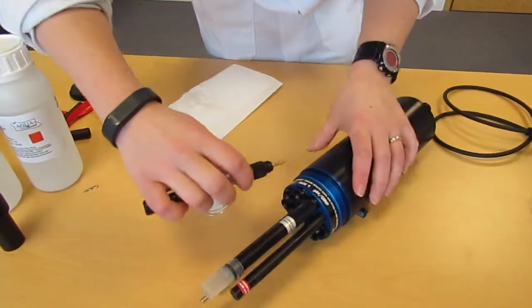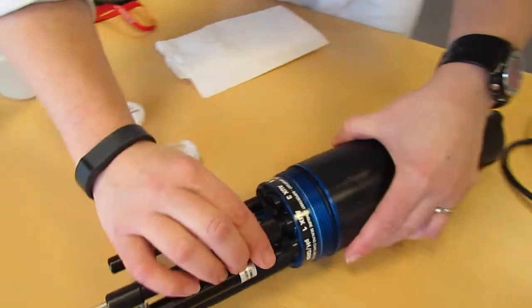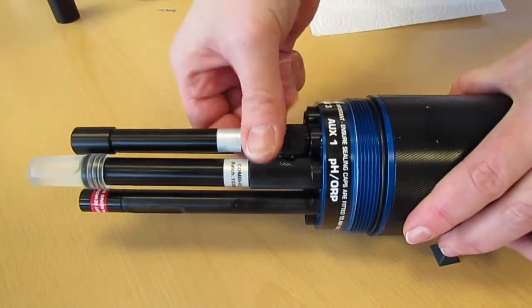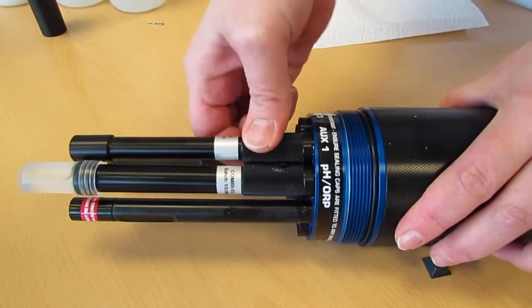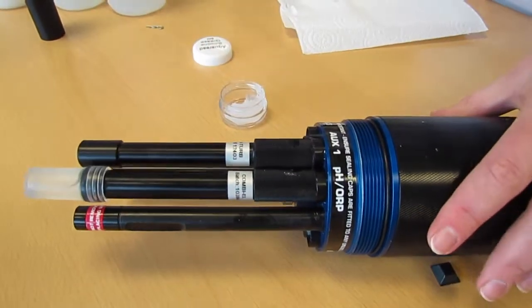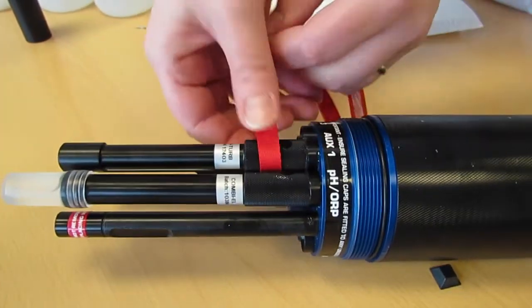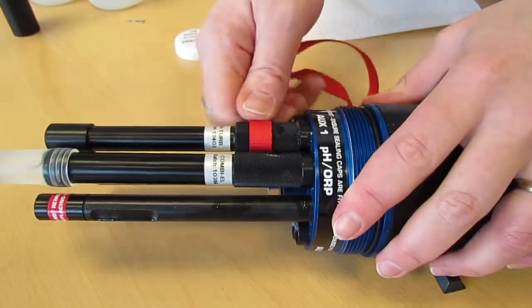This can then be installed into any of the AUX sockets. I'm going to install it into AUX1 on this occasion. This needs to be screwed in as hard as possible by hand, and then using the red lanyard as tight as you can get it.